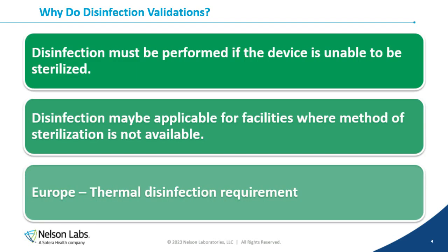So why do disinfections? Why are they an option? Well, disinfections must be performed if the device is unable to be sterilized. In a perfect world, it would be great if every device could be sterilized. That would ensure that all devices are safe to be used. However, that's just not the case. Some devices are just unable to be sterilized, whether that is due to the size or the material made of the device. And in some cases, it's just not necessary because the device has low risk of transmission of infection.